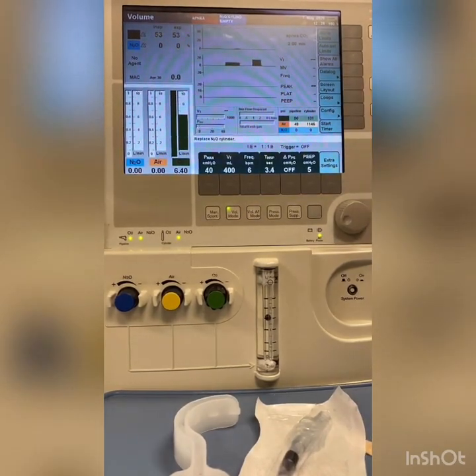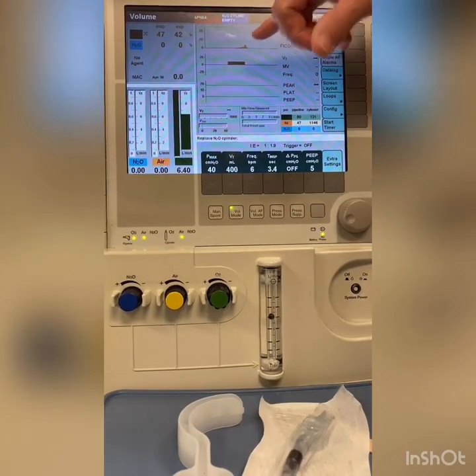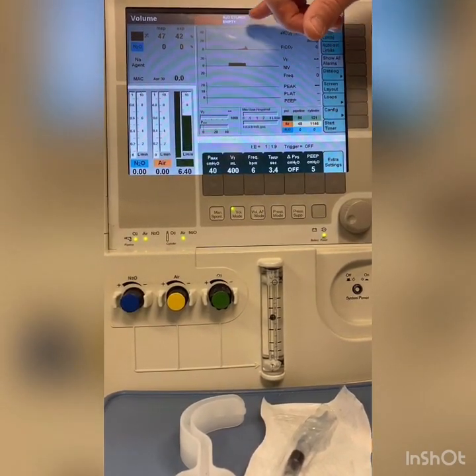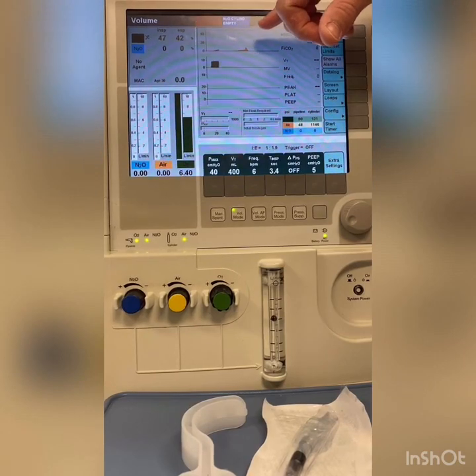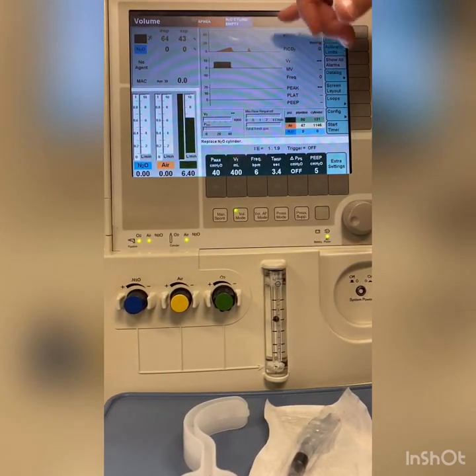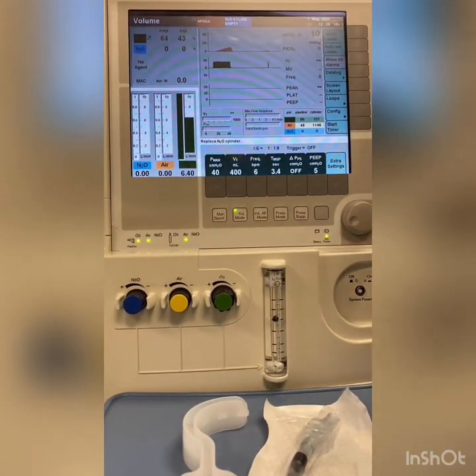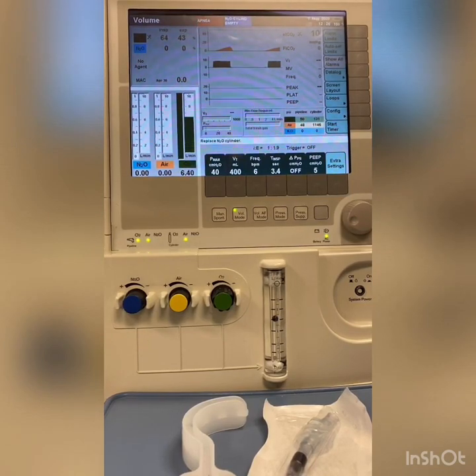The other indication, Kelsey pointed out in her video, is that you will start to see on the exhalation that they have an inspiratory movement, we call it a Curare cleft, during our end-tidal CO2 waveform.